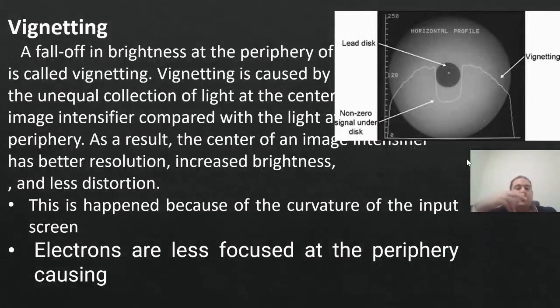This works with generating artifacts, which means that you feel there is an image here. I brought a disc made of lead, and I took a picture of it. If you now bring a metallic object and place it under the X-ray tube, this part should appear white on the film, not black. Why did the white turn black here?